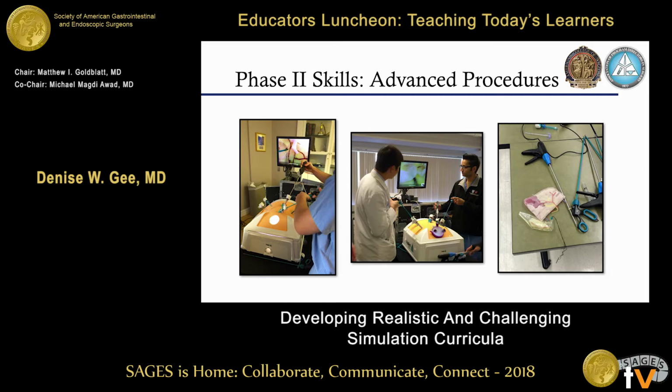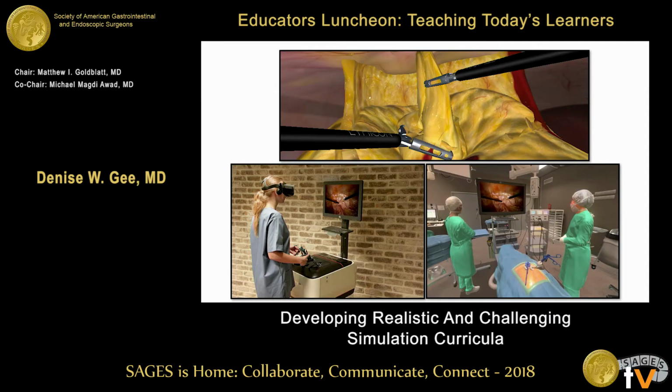And as you move into more of these advanced procedures and more senior residents, this may be a time that if you have access to VR simulators, this is for lap ventral hernia, and now there are immersive VR technologies as well. If your institution happens to have access to that, and that's where you're performing these procedures, you put on these VR goggles, and you're actually immersed in an operating room environment.